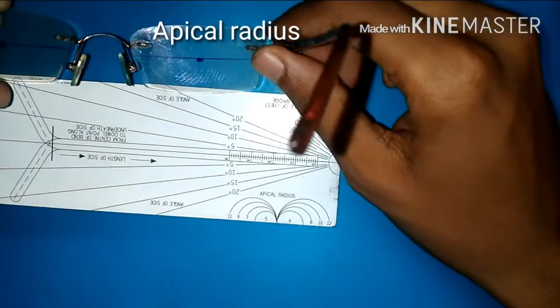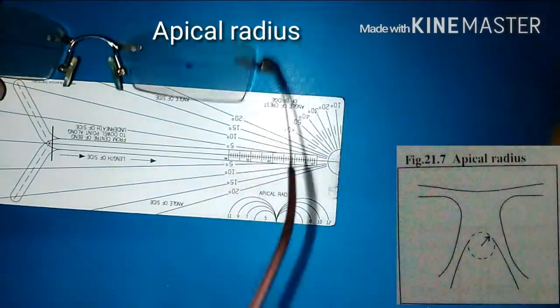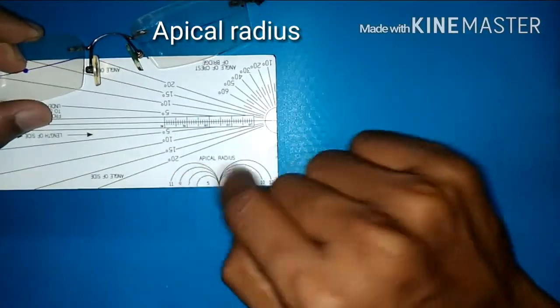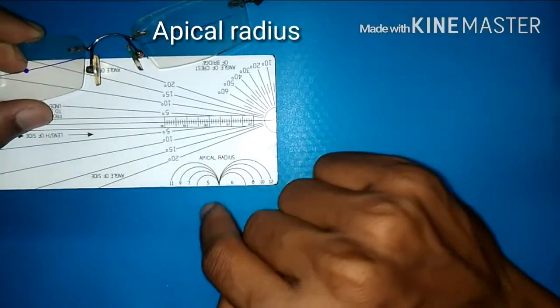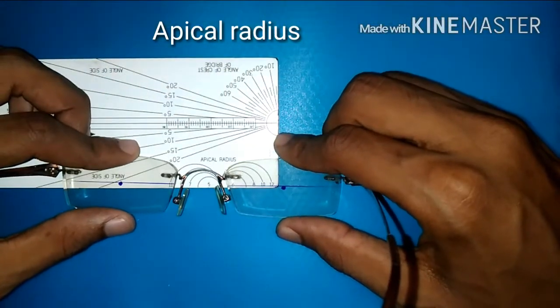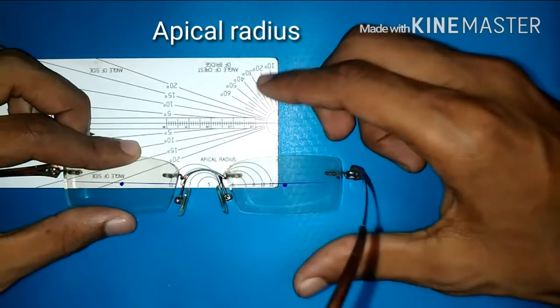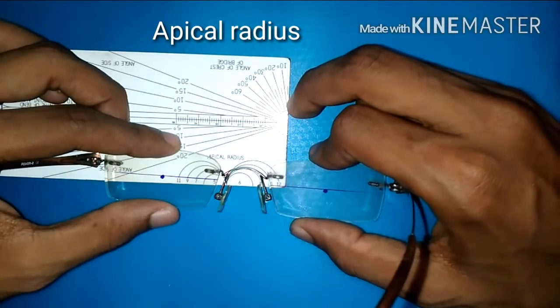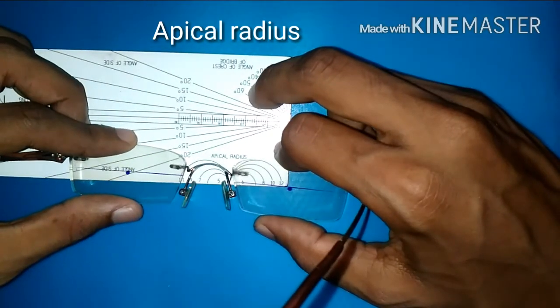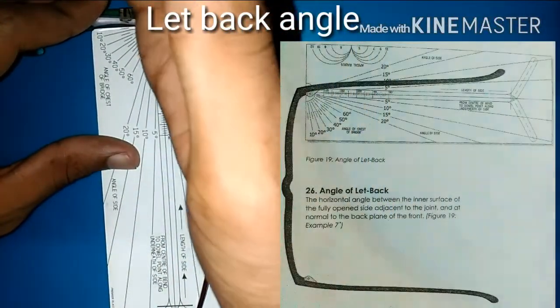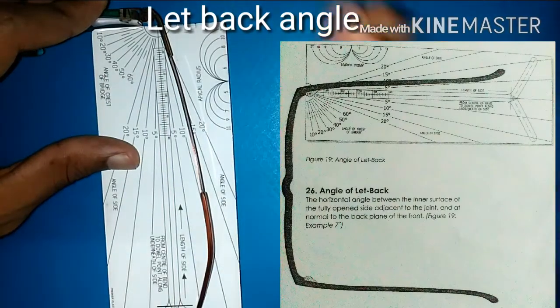The apical radius is the radius of the arc forming the lower edge of the bridge. To measure that, there are arcs given from 5 to 12, and we have to match the exact arc where the frame and the ruler match. With 7 it's smaller, with 8 it's almost equal, with 9 it's bigger — so we go for 8.